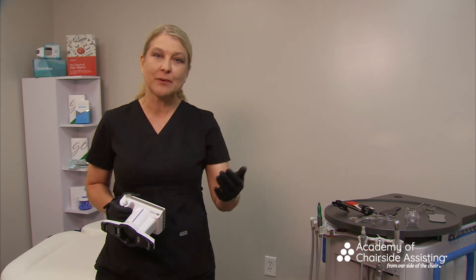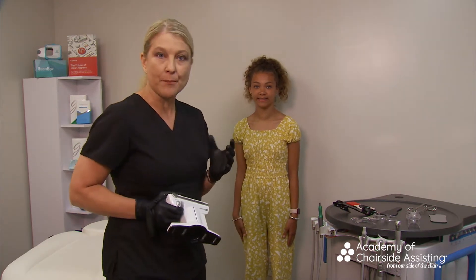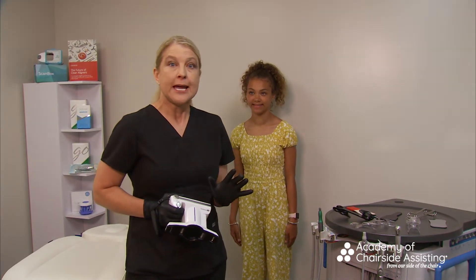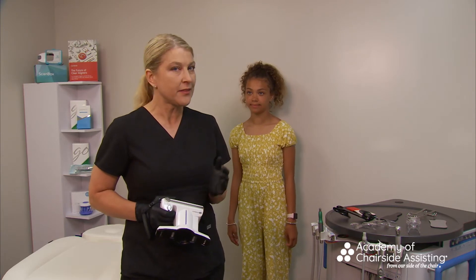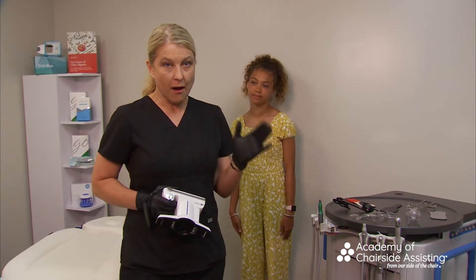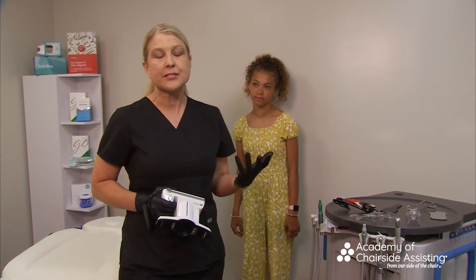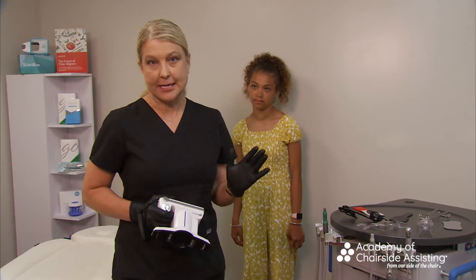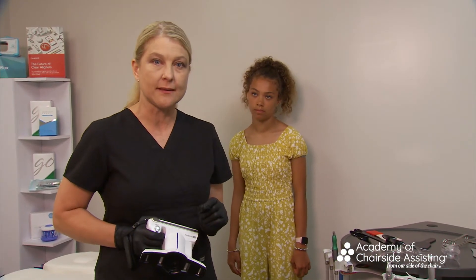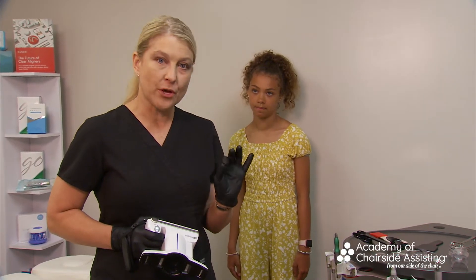Today our patient Kylie and I will go through some of the things you really need to think about — most importantly troubleshooting. We want to start with full face photos. We're going to put up guides in this module covering all different types of photos. We like to follow a simple orthodontic step-by-step series of images, so I'll explain why we take each one.